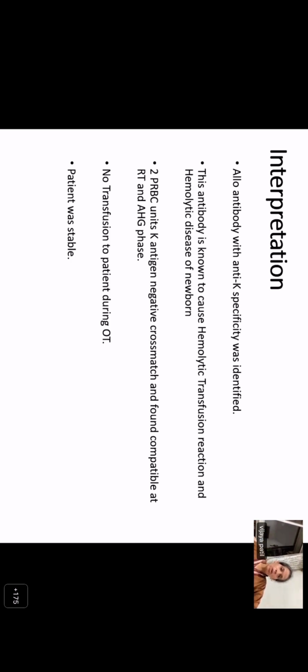Correct. So as I said, the 72-hour interval has been the norm that is being followed, and even today we follow the same norm. But with improved antibody detection and screening methodologies, there have been cases where, even within that span of 72 hours, because some transfusion has happened and the patient is immunologically very reactive, the patient has developed an antibody, and suddenly you find that the units that were compatible 2 days back now show some mild incompatibility or 1+ agglutination.